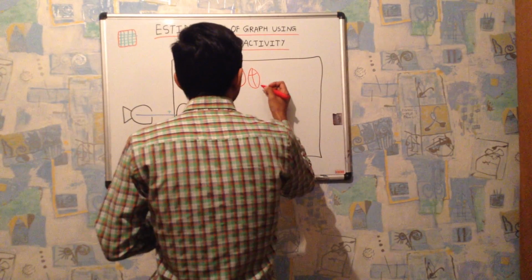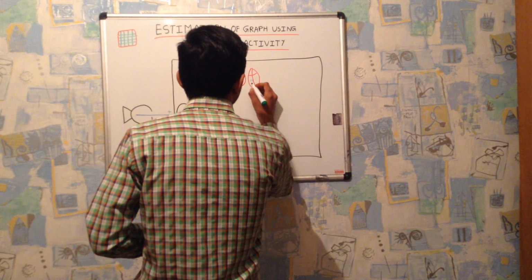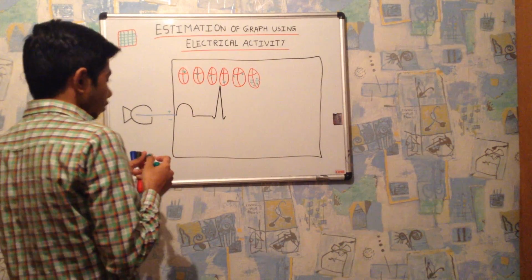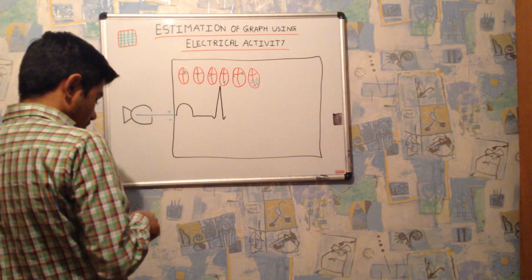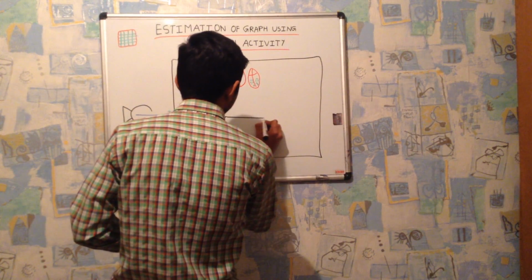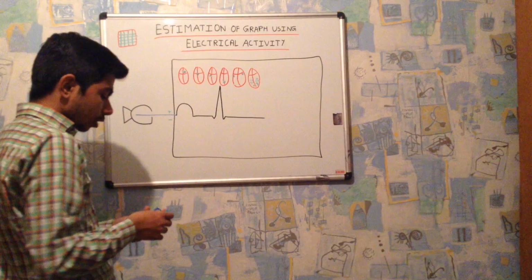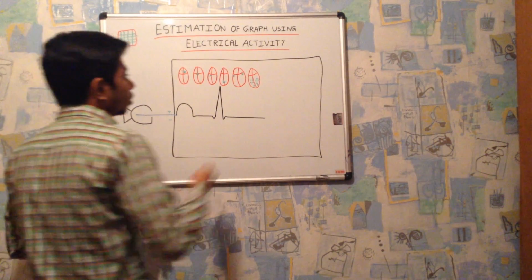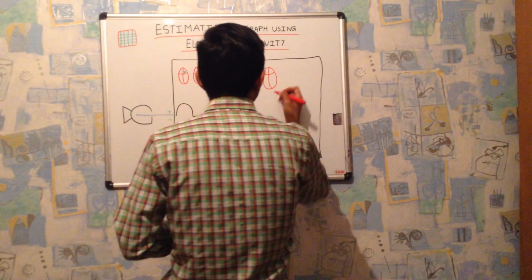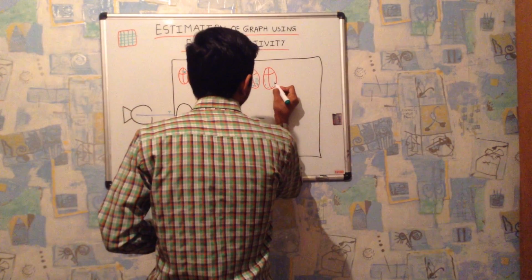At this stage, now the heart is fully depolarized, due to which there will be no fluctuation in our needle. But after the depolarization, repolarization should also occur inside our heart. So there will be the starting of repolarization inside our heart. The repolarization will start from here.